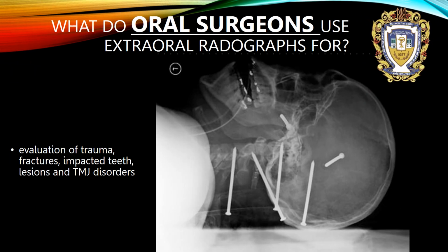What do oral surgeons use extraoral radiographs for? Oral surgeons use extraoral radiographs to evaluate trauma, fractures, impacted teeth, lesions, and temporomandibular joint disorders.